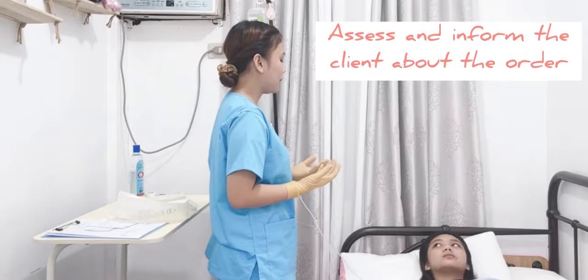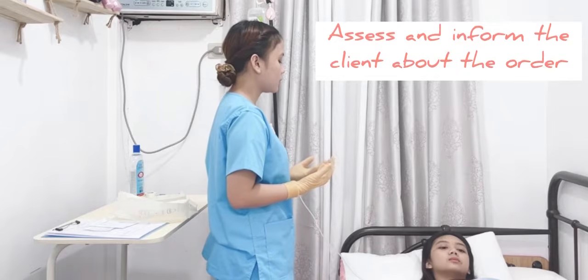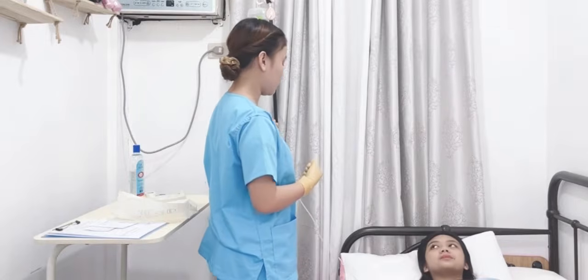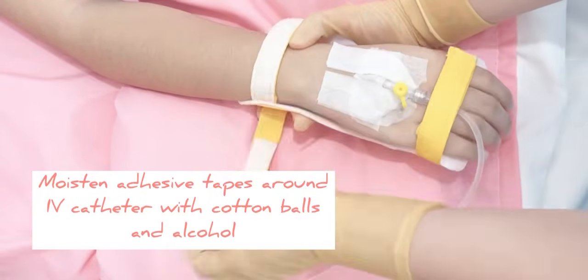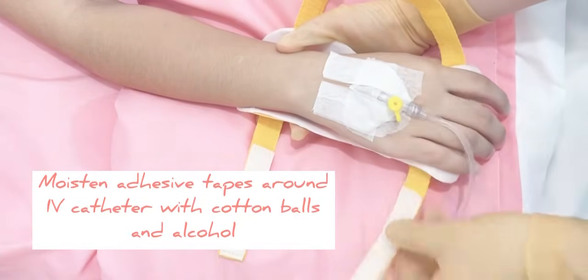Then assess and inform the client about the procedure. It ensures cooperation during the procedure. So ma'am, ngayon po, titigil na po natin yung sa IV fluid niyo po. Then moisten adhesive tapes around the IV catheter with cotton balls and alcohol. It exposes needle or catheter with minimal discomfort.